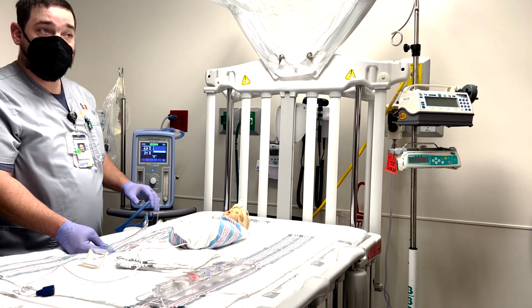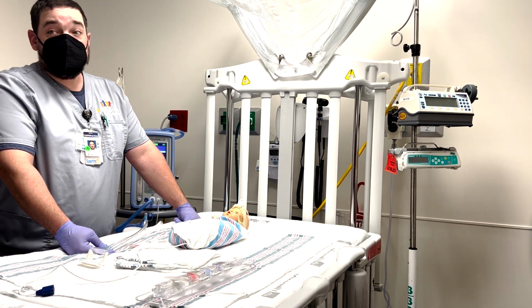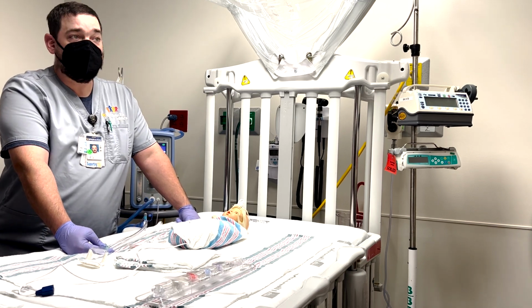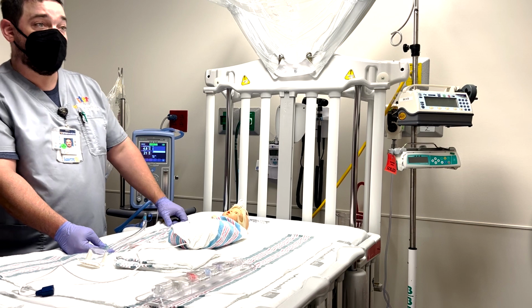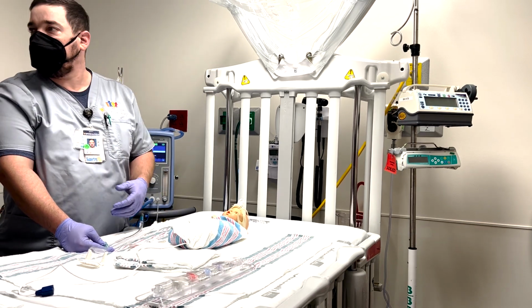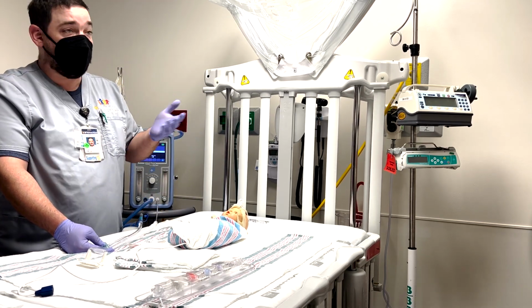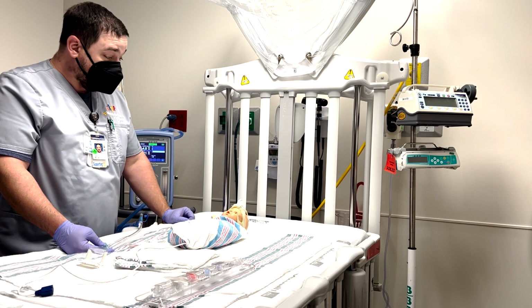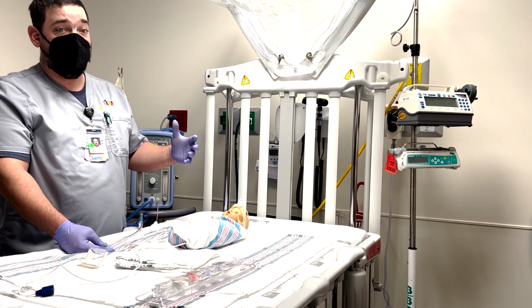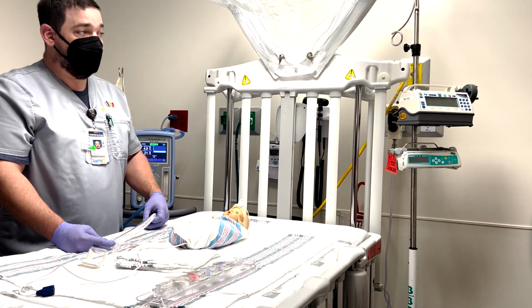If they do well on CPAP, would you put them to high flow, or would you just put them to a normal nasal cannula? It depends on their oxygen requirement and their work of breathing. If I don't have to give them O2, great. Let's see what they do on room air. If I am on 5 and maybe 30%, let's see what they do on a quarter liter and see if I can match it that way. Definitely, as much as they may or may not agree with you, nasal cannula is more comfortable than having something strapped to your head. For sure.